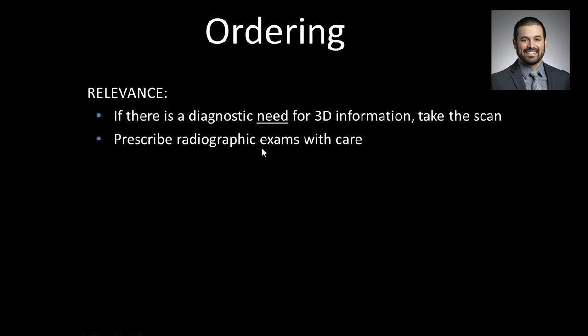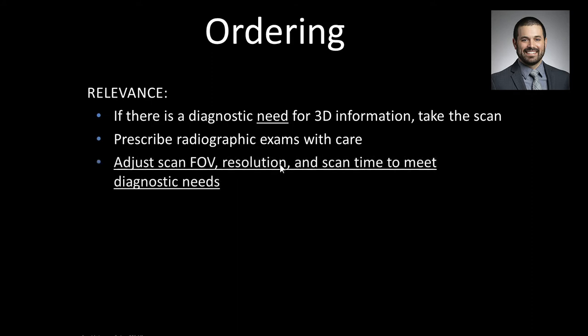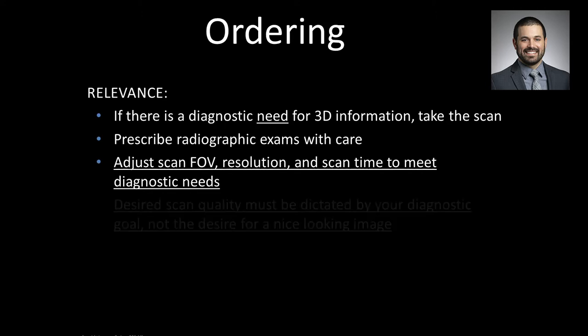But you do have to prescribe radiographic exams with care. And part of that care is adjusting our scan field of view, resolution, and scan times to meet diagnostic needs. And we drove into each one of these factors quite in depth last week to really understand what the machine is doing and what it means for image quality and dose for our patients.